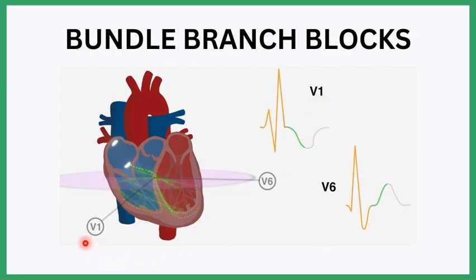That's why we have one right chest lead and one left chest lead.